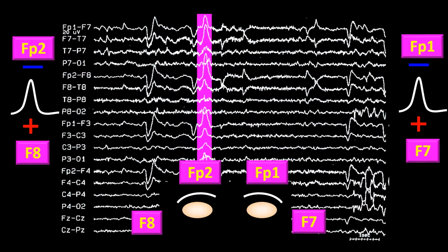Now, incorporating the eyes, as I have done in the prior question, and the suggested field, this would indicate that the eyes are looking down.